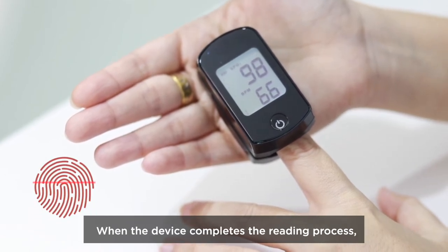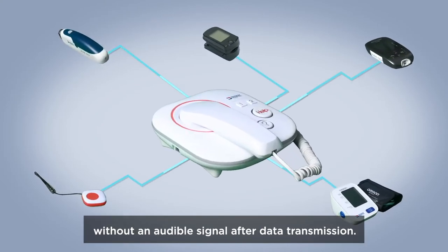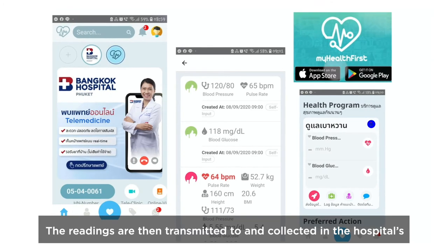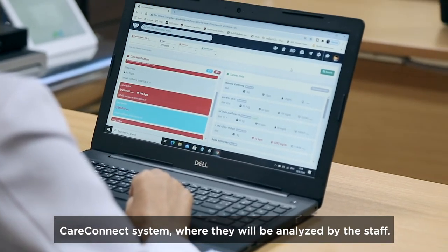When the device completes the reading process, the result is automatically recorded without an audible signal after data transmission. The readings are then transmitted to and collected in the hospital's CareConnect system, where they will be analyzed by the staff.